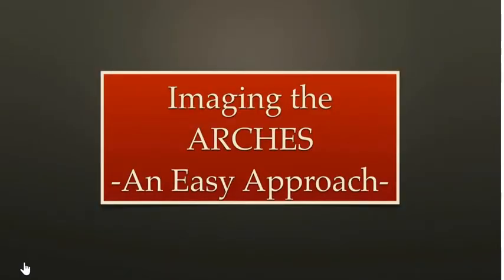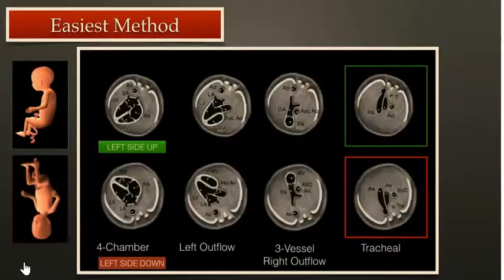Now let's review how to image the aortic and ductal arches. Most examiners use what I call the wandering approach, in which they move the probe in a random manner. However, there is a systematic approach which I have found useful when imaging the ductal and aortic arches.